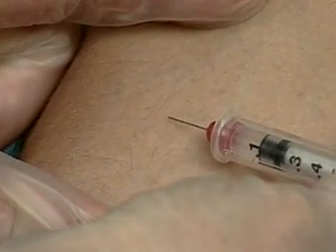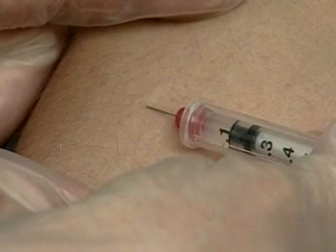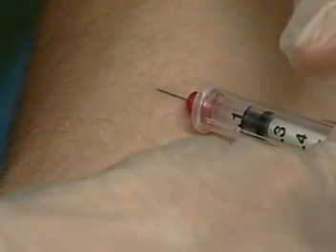Stretch the skin taut. With the bevel of the needle up, slowly insert the needle at a 5 to 15 degree angle. Advance the needle between the layers of the skin just enough to cover the bevel. The tip of the needle should be visible through the skin.